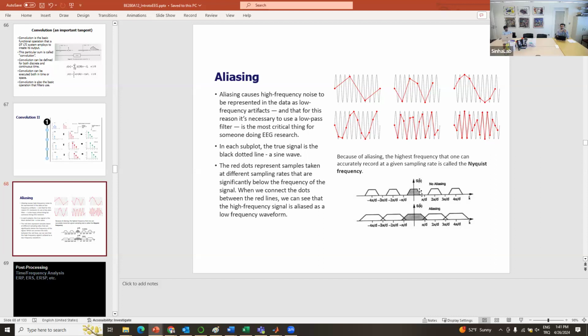So aliasing is something very intrinsic to real life, and although it looks mathematical in this slide, it is very real and very much part of our everyday life. That's why, when I choose my downsampling rate to be 256, I have to make sure that the maximum frequency available in my signal is no bigger than 128. If it's bigger than 128, I'm going to have aliasing due to this replica phenomenon.